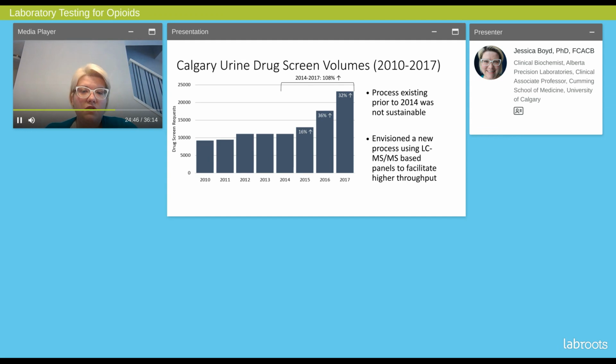So in the last few minutes, I just wanted to show you some of what we've done in Calgary to try and address our issues with the opioid epidemic.